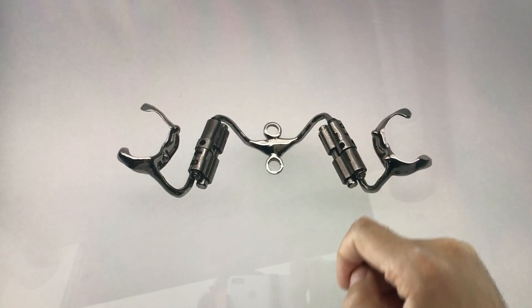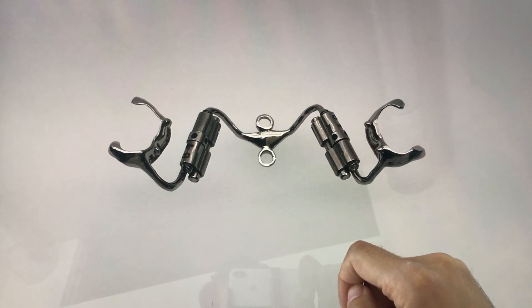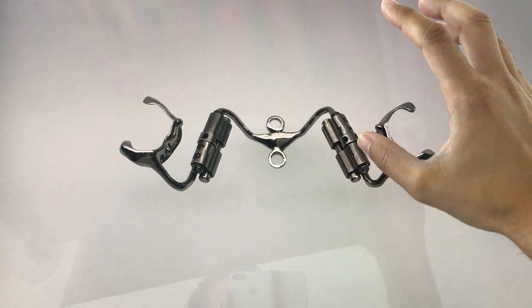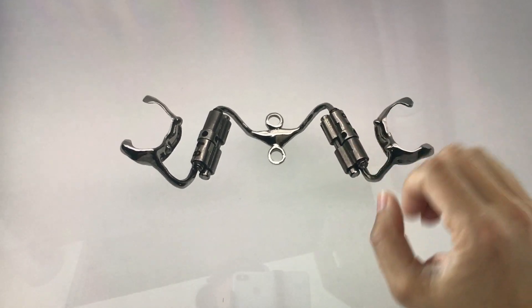What is also nice with the distalizer is you always have control on the root torque. It just goes straight because the appliance grabs the tooth bodily and pushes it — there is no way it can tilt.